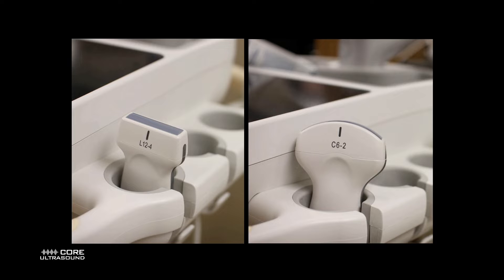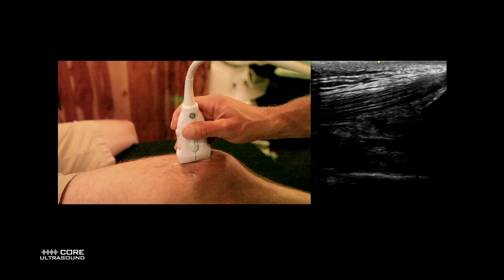With this exam, you can use the linear or the curvilinear transducer. I usually go for the linear, but if you need a wider field of view, the curvilinear can work as well.